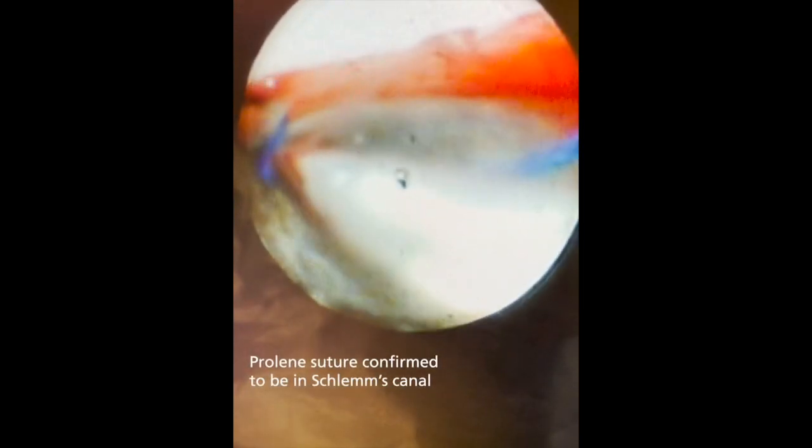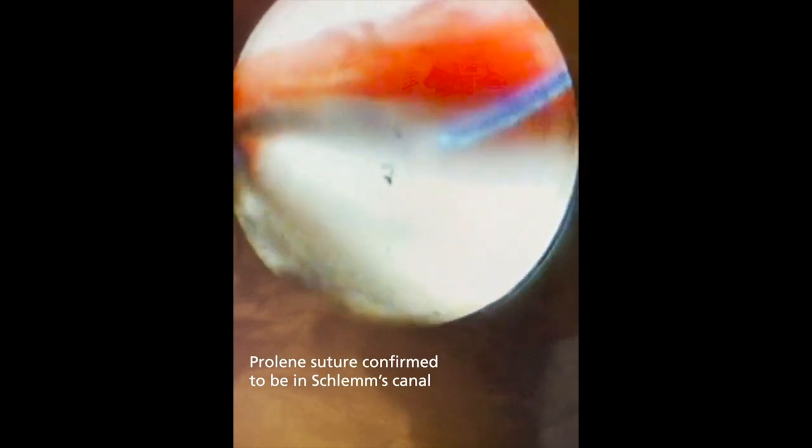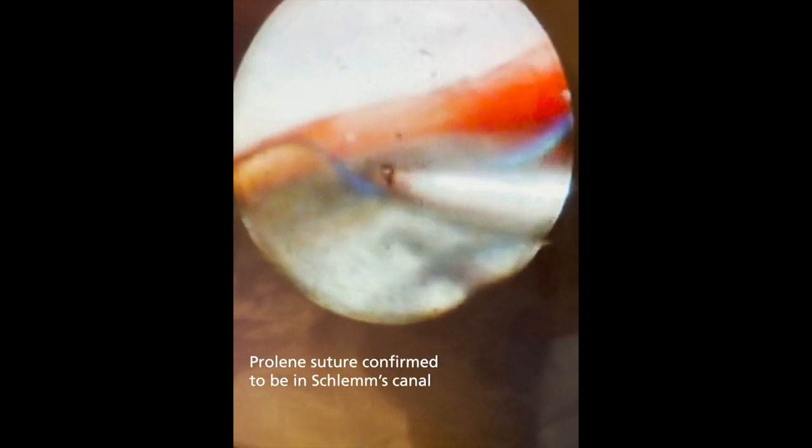There was a little bit of a membrane over the trabecular meshwork which we had to navigate, and there are circumstances in uveitic or other eyes prone to scarring where we can feed the suture just behind the membrane and not in Schlemm's canal. And you can see here this membrane that we're able to dissect a little bit, but you can also see the blue tint of the suture behind the trabecular meshwork, confirming our placement in Schlemm's canal.